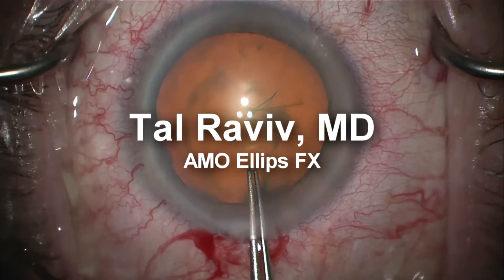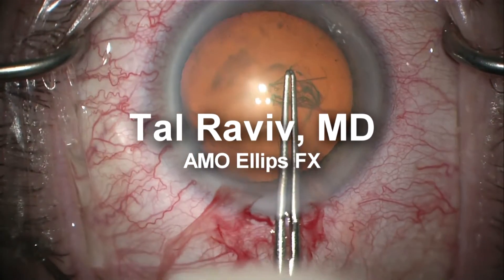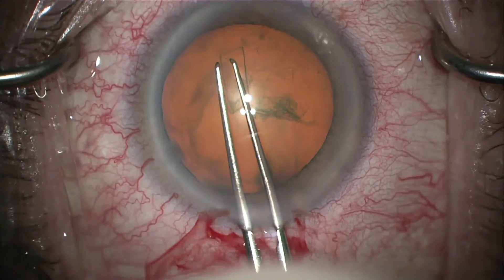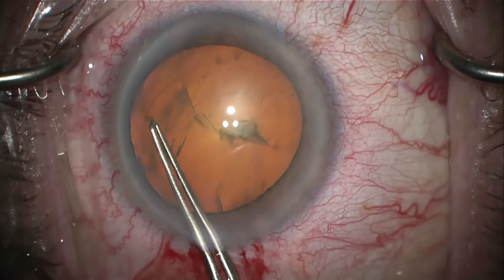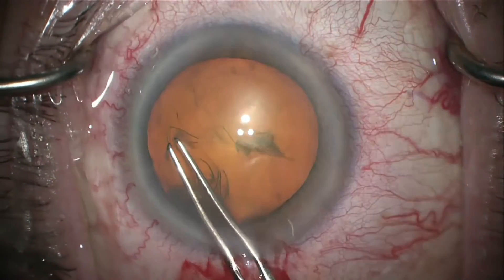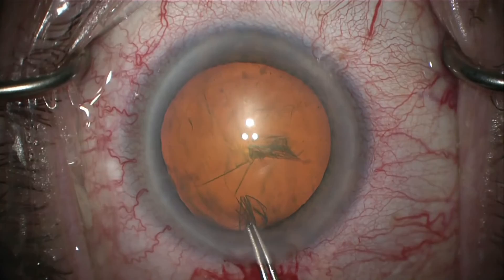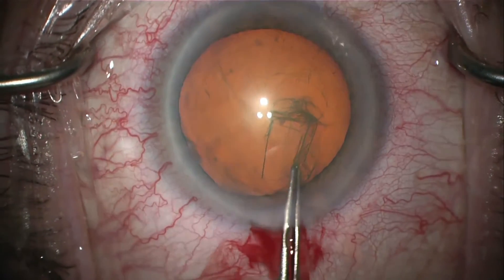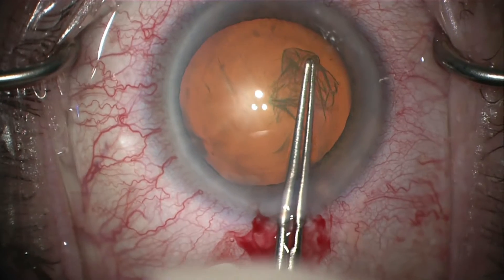This is a demonstration of cataract surgery using the AMO Signature Ellipse FX handpiece. I begin by constructing a continuous 5.5mm capsulorrhexis. You can see the beautiful red reflex afforded by the optics of the Zeiss Omero microscope.